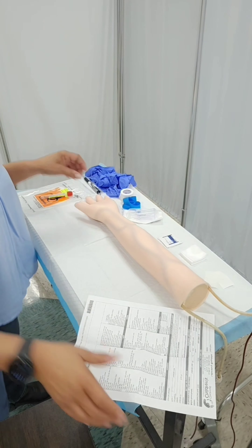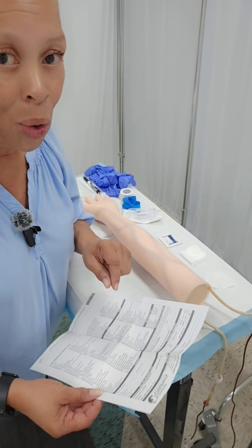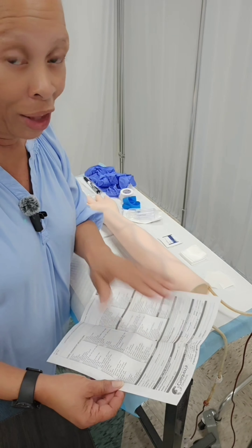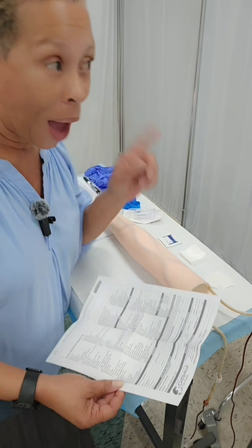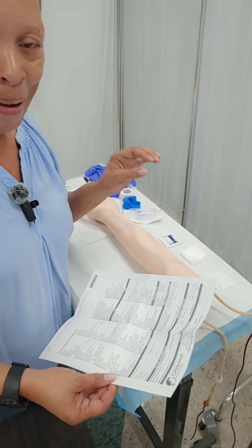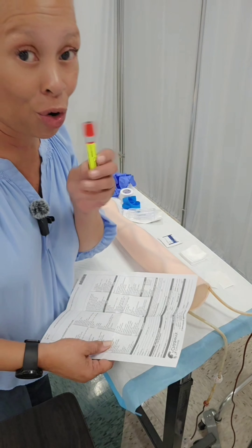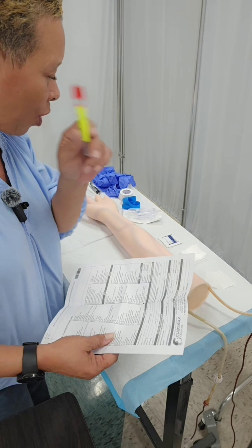You'll want to make sure that you check the name on the lab order or lab requisition form and have your patient state their name and birth date, then compare it with what is on your doctor's order or lab requisition form — because you want to make sure you're sticking the right patient. I'm also going to double check which lab I need to draw to make sure I have the correct container. I'm doing a renal panel, so I have a red top here.